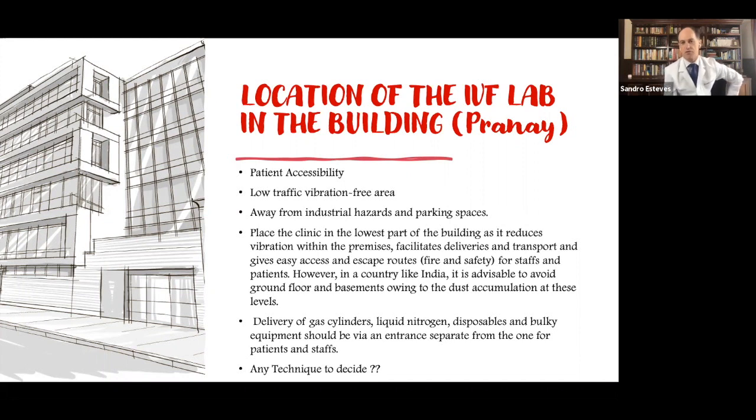I think it's essential to have a risk management analysis. I mean, there's no magic formula that we could apply everywhere. We obviously need to follow the regulations, because the number of rooms and the way we design our labs are also regulated. But I feel it's essential to have a risk management analysis.